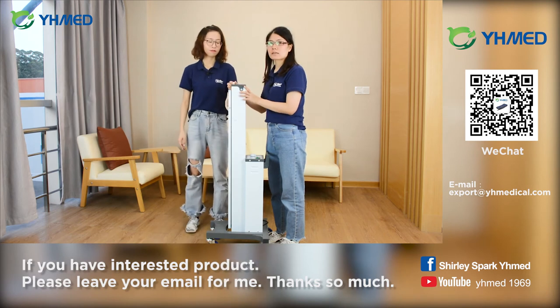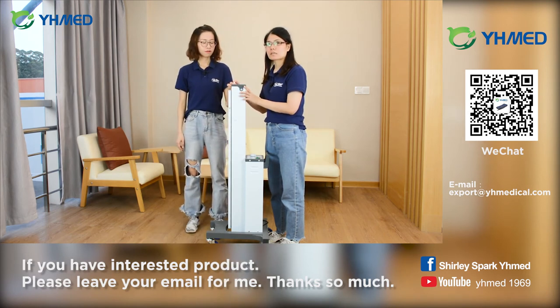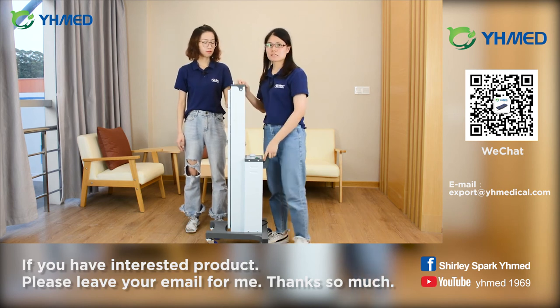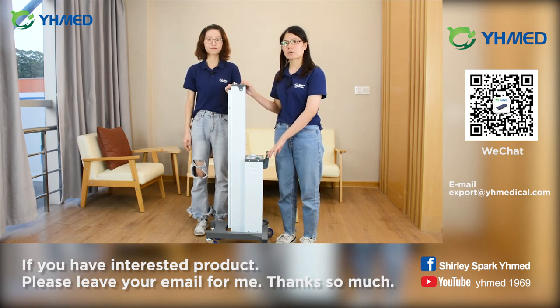For this step, it is very important. Please remember to press the arm ledge. This machine is very practical and easy to operate.